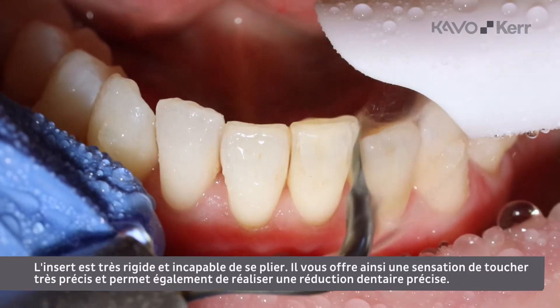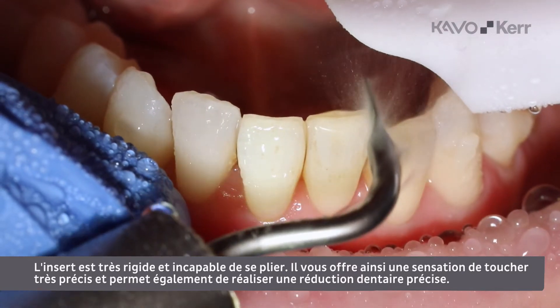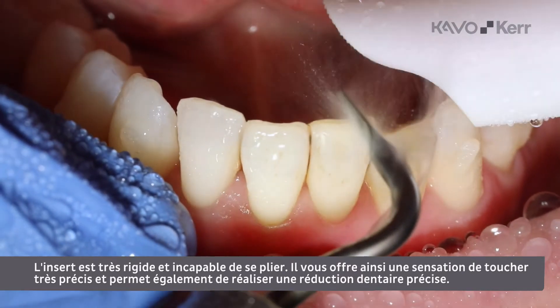The tip is very stiff and unable to bend. This gives you very accurate tactile sensation and the ability to perform a precise tooth reduction.